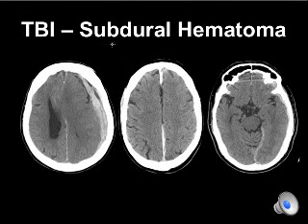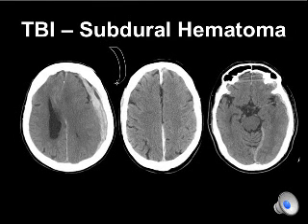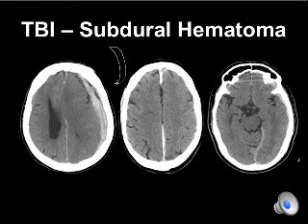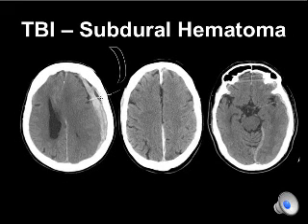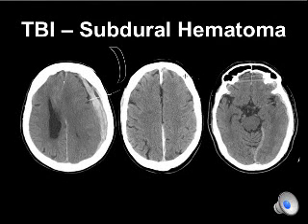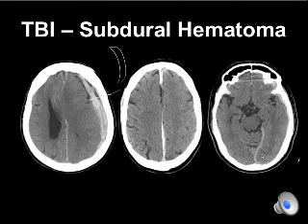The shape is quite different — it's not anymore this biconvex lens; instead it's a crescentic shape. For epidural hematomas, they could not cross sutures but could cross dural attachments — it's exactly the opposite for subdural hematomas. As you can see, they can cross sutures — this is the coronal suture, and you can see the subdural hematoma extends through it. On the other hand, subdural hematomas cannot cross dural attachments; they extend along them — for instance, along the falx and along the tentorium.